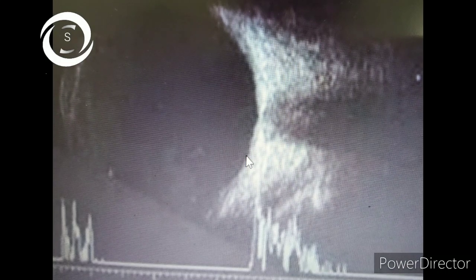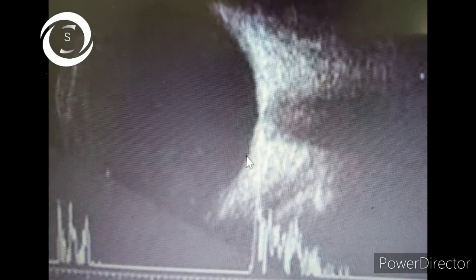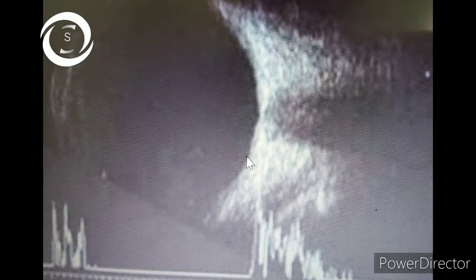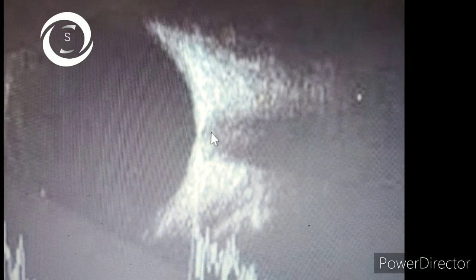Then go more posterior, and you can see a reflective membrane in front of the retina. This can be posterior vitreous detachment or retinal detachment, because a thick PVD can confuse you with retinal detachment. We will discuss later on how to differentiate the two.